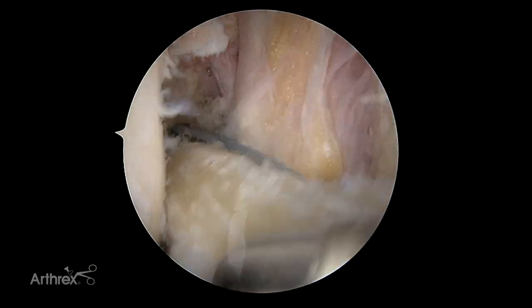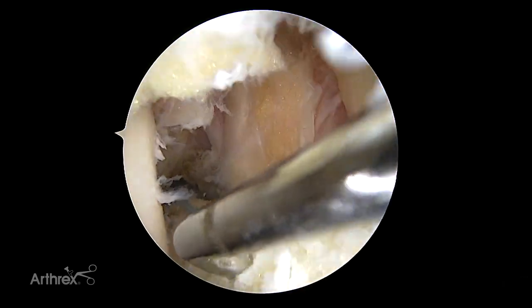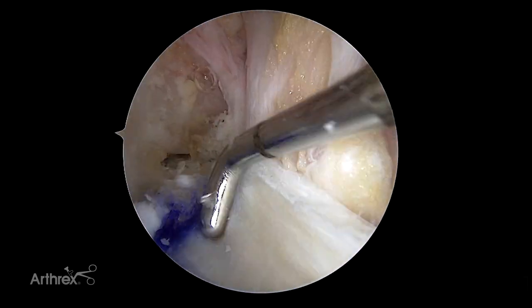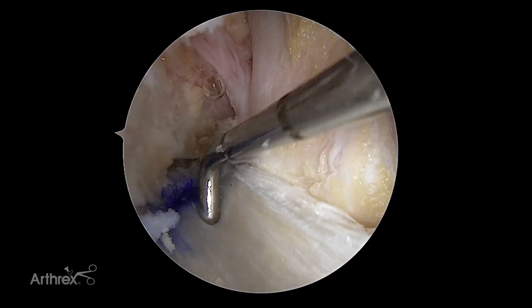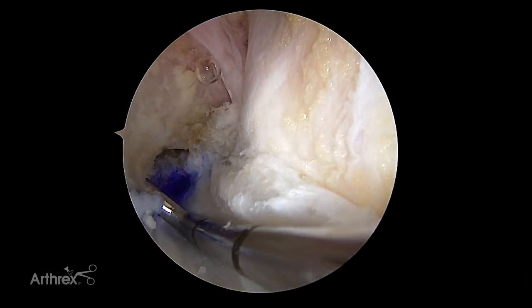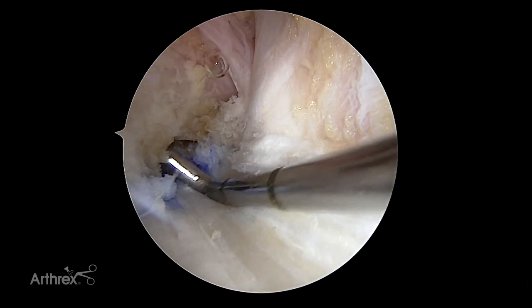This is a small knee. We're pulling that in and orienting — importantly — the bone part of the plug anterior and superior, and the tendinous portion posterior and inferior in a flexed position. This creates the safest interface for our interference screw to be placed anterosuperior.